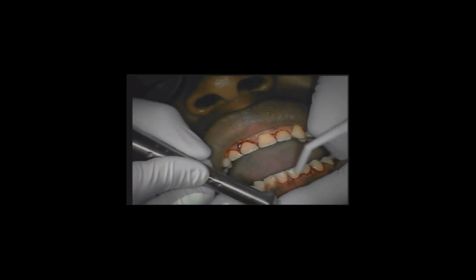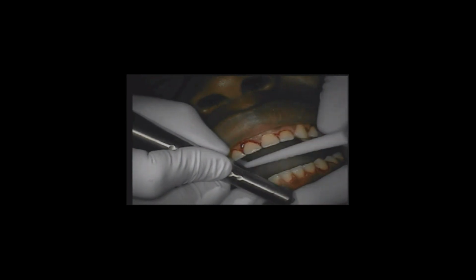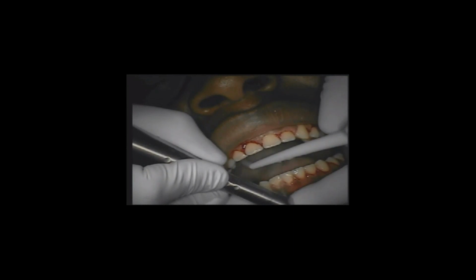And if possible, like you see the angle I'm trying to come at, if I can come at about a 45-degree angle as I remove this redundant tissue, I've already established the outline of my gingival bevel from the get-go, and it just saves time when we go to the tipless handpiece to finish that bevel.